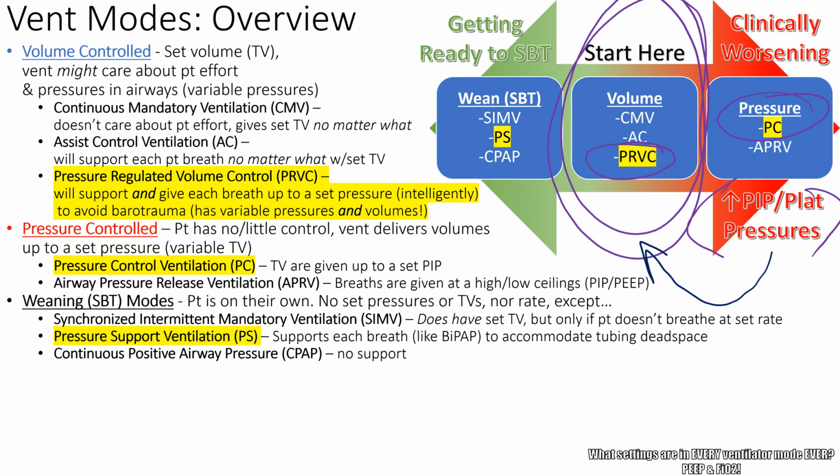They're going to start going this way, and then they can even go into a weaning mode, where you're doing an SBT of some sort, a spontaneous breathing trial, where you're saying, hey, you're doing great on PRVC, let's see how you do on your own, right? And these are weaning modes. And the best one is pressure support. Colloquially, we always say, put them on CPAP. They're on CPAP, you're on CPAP. Are you on CPAP? And no one's on CPAP, I promise you, right?